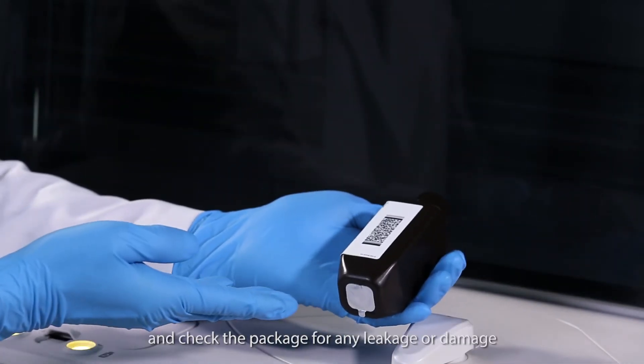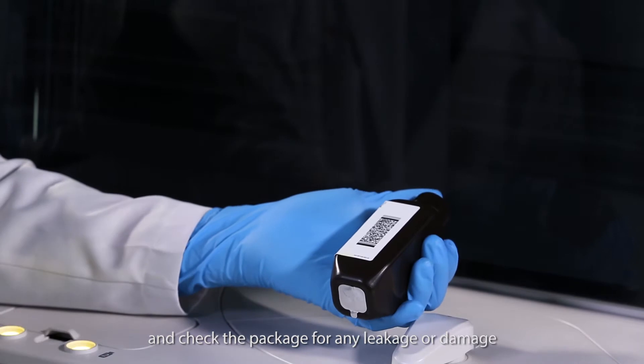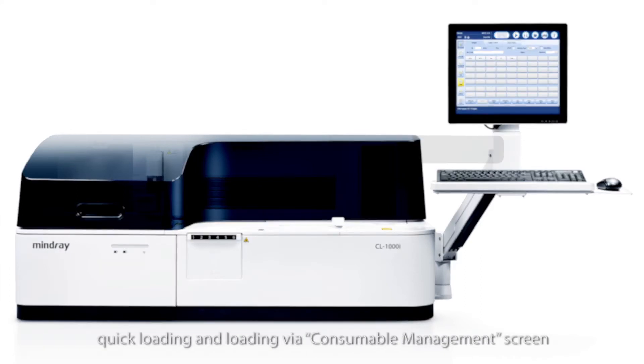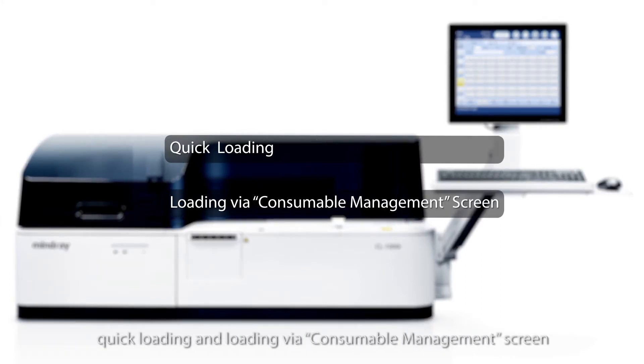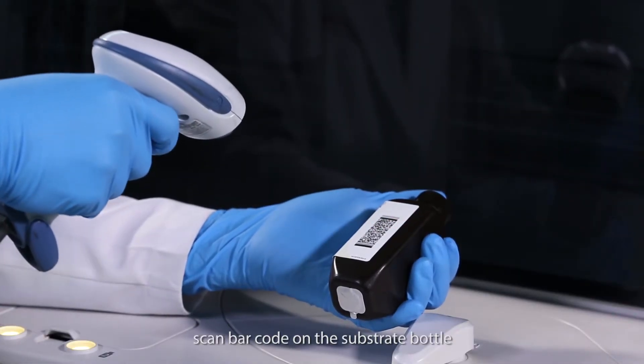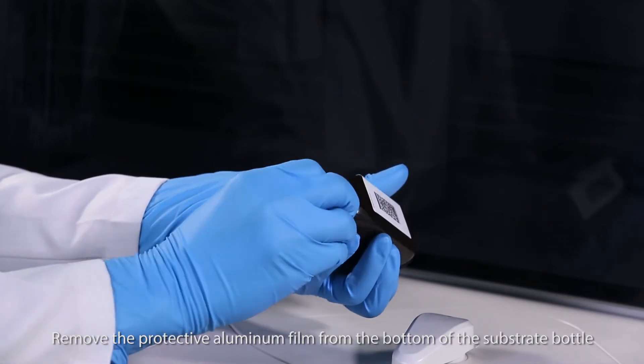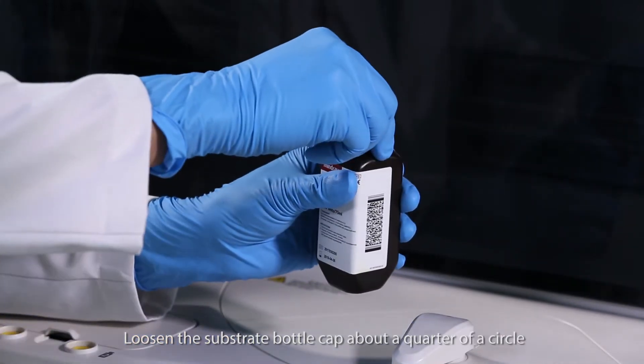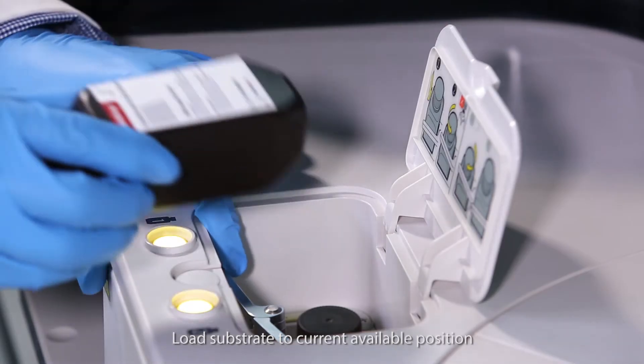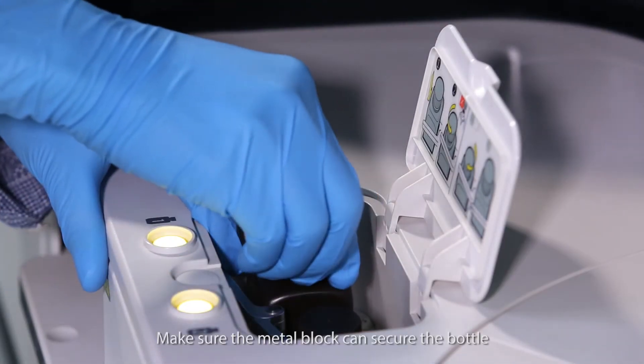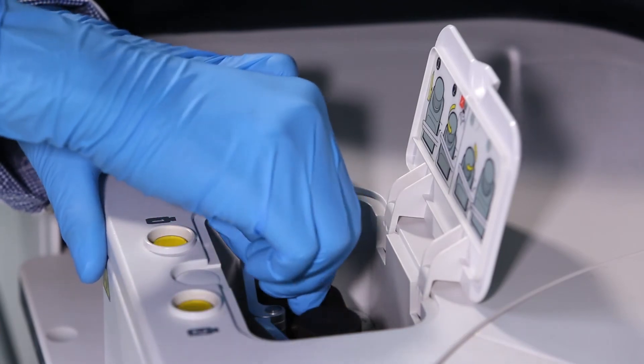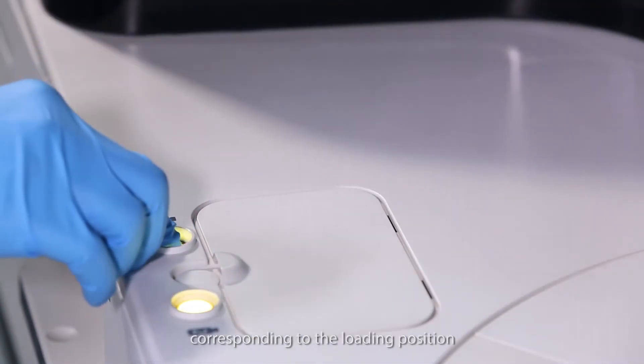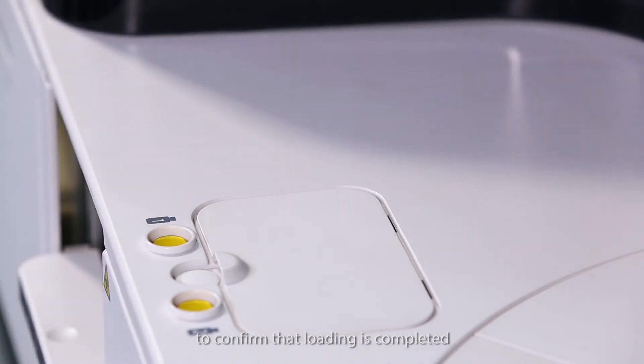Take one bottle of substrate and check the package for any leakage or damage. Equilibriate in room temperature for more than 6 hours. There are two ways to load the substrate: quick loading and loading via consumable management screen. For quick loading, scan barcode on the substrate bottle. Remove the protective aluminum film from the bottom of the substrate bottle. Loosen the substrate bottle cap about a quarter of a circle. Load substrate to current available position. Make sure the metal block can secure the bottle. Loosen the cap for a circle, but do not remove it. Press the indication light corresponding to the loading position to confirm that loading is completed.